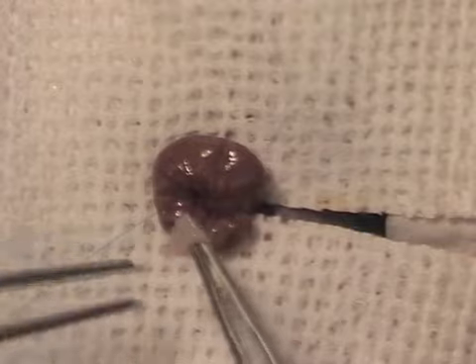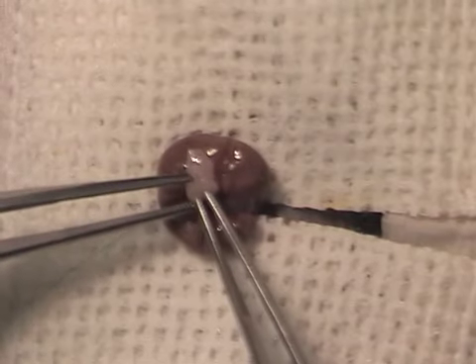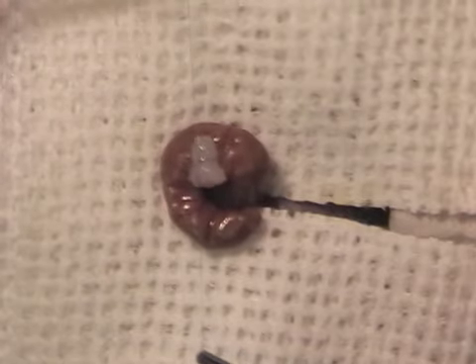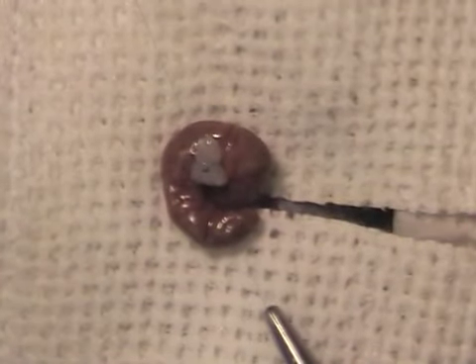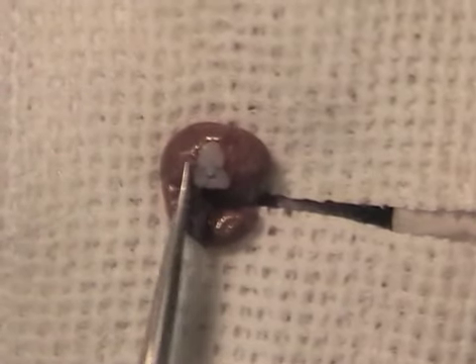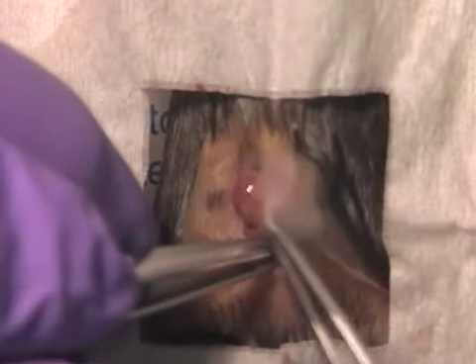Then, the tumor piece is properly positioned. The stitch is tied down. The cecum is returned to the abdominal cavity.